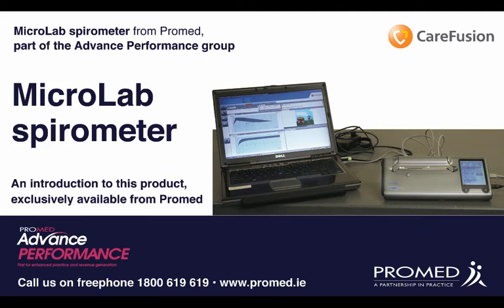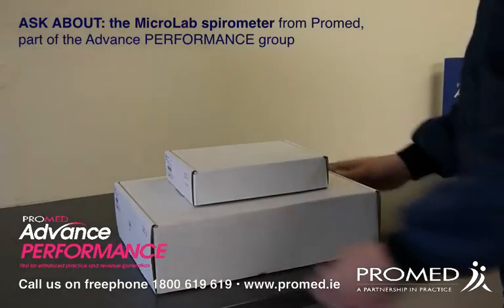Introducing the Microlab Spirometer from ProMed. This is sold as part of the Advanced Performance Group of Equipment.